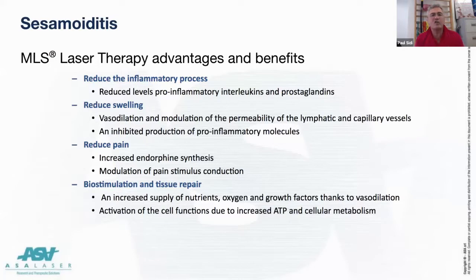It will reduce swelling. By changing the effects with the levels of Hertz, we can actually increase the mechanical effect of this, so we can start flushing fluids through there. You're getting an increase in heat, but not enough to cause any damage. This is a class 4 laser. It's sending in on the 905 nanometers, it's sending in 25 watts. That is going to cook you.